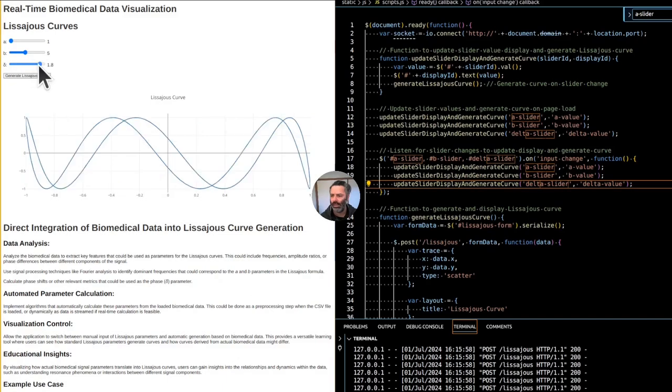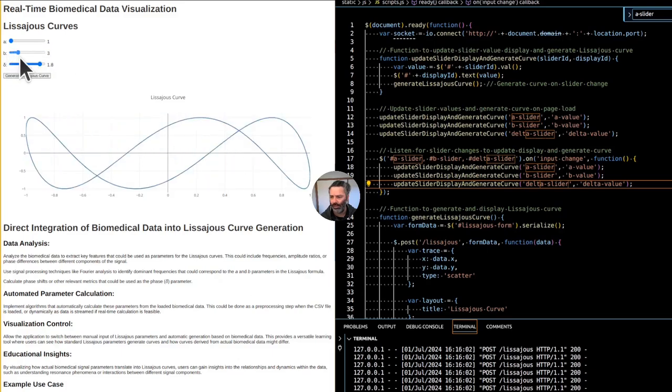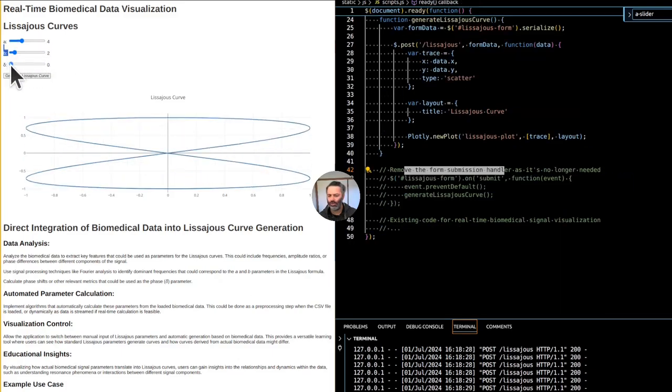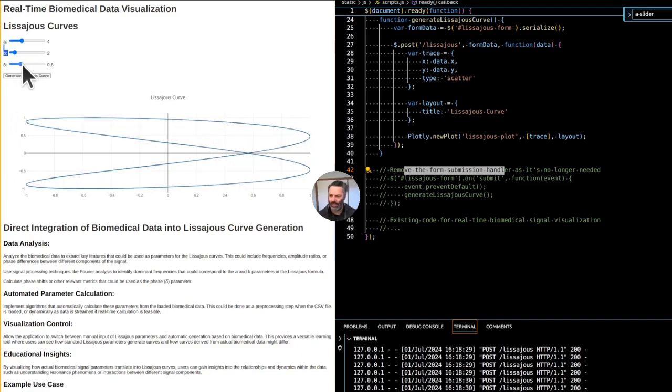Okay, this is actually updating when we're changing the values. This number should be going negative as well.